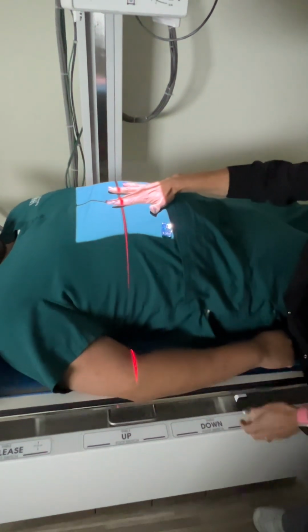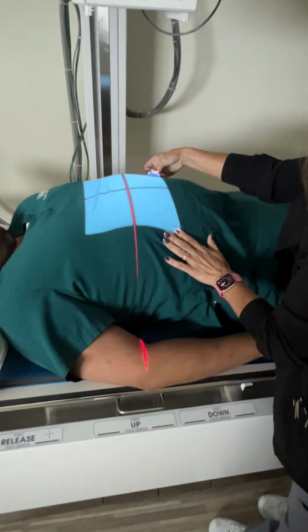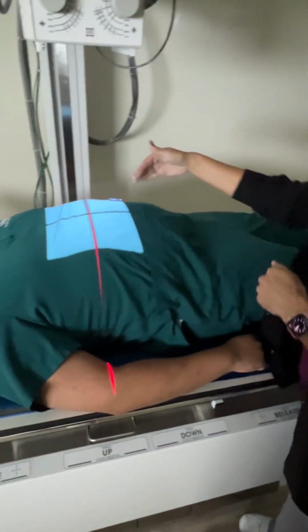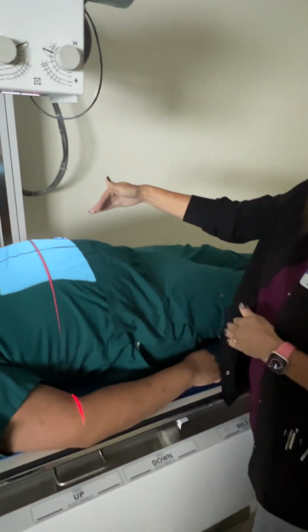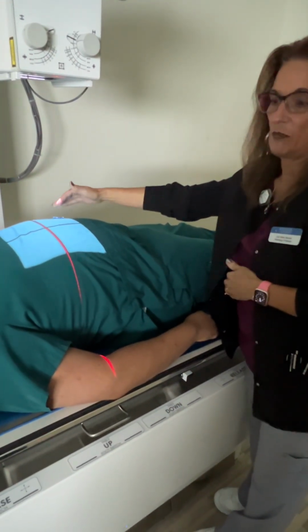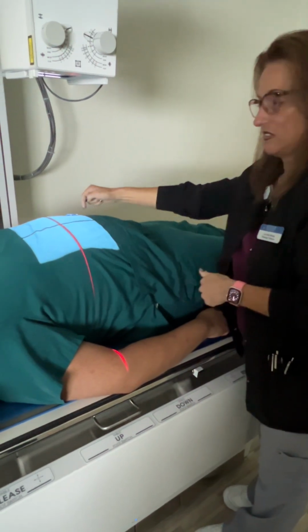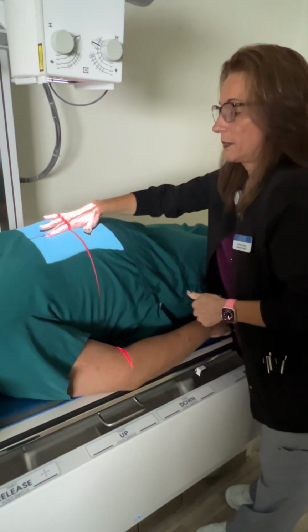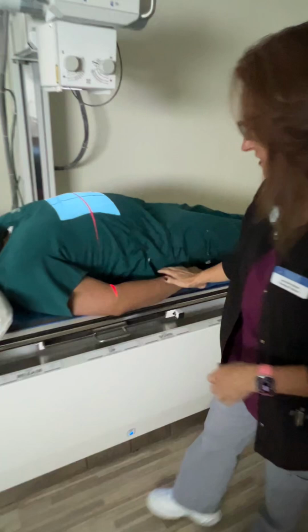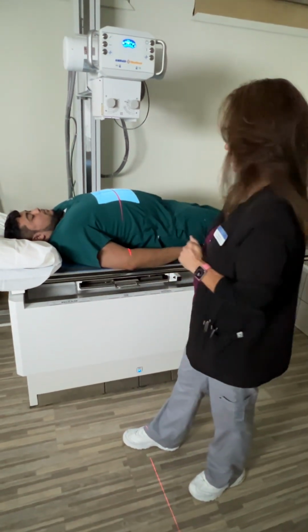I want to make sure I'm still midline. And then this is not his left side, so I'm going to move it back over here. And that marker, even though it seems like it'll be in anatomy, in the first image, that would not have the marker, so it's visible in the first image, even though it's going to be obscured in the second image. All right, and I'm going to have his breathing the same. Everything's still lined up because the only thing I moved was the table.